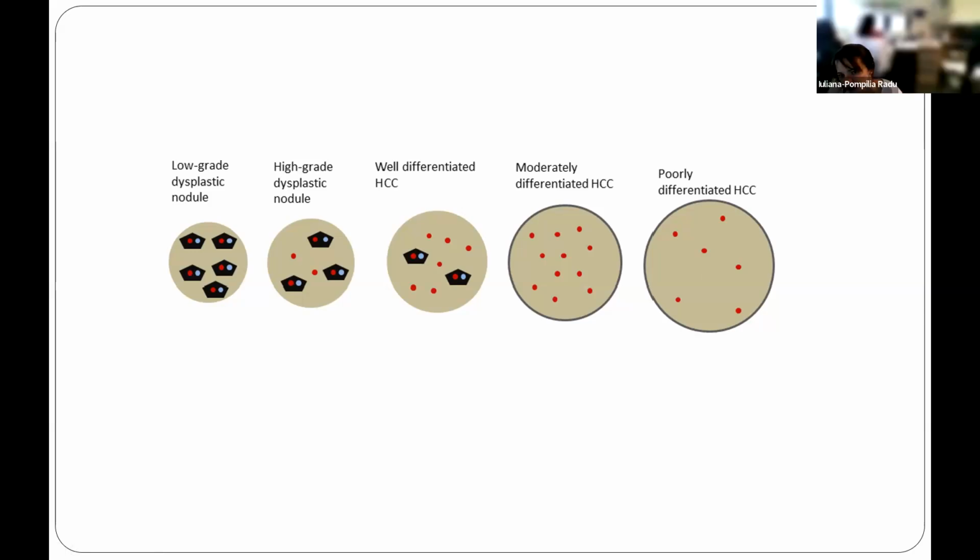Yeah, there are studies that say that after one week you can do it, but as I said, sometimes until 5 days there is this inflammation, and then you can have a problem: this inflammatory peripheral rim can mimic a rest of the HCC.